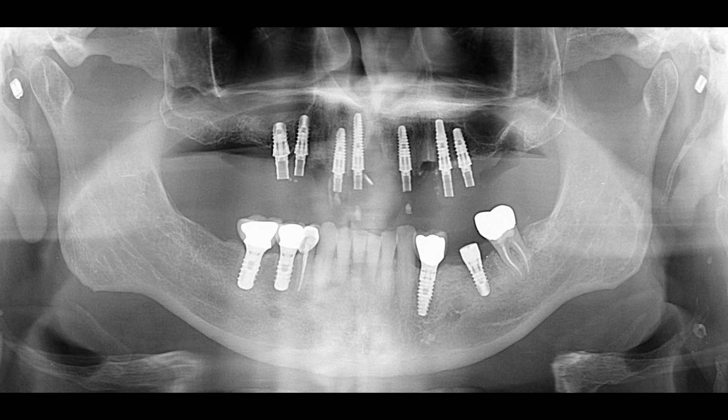We also do that on purpose to maintain the fullness of the soft tissues. If we take a tooth out and we don't place an implant in a socket, those tissues and bone will retract quite a bit, and it leaves a slight concavity where we would rather not have that. If the tooth migrates out of the bone, it's very easy to extract later. So there's several of these cases that you'll see where we did leave some roots behind, and that is on purpose.